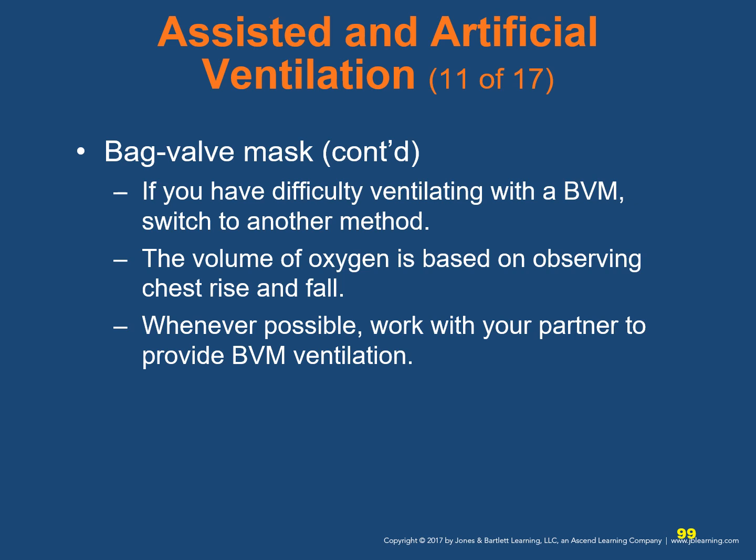Bring the lower jaw up to the mask with the last 3 fingers of your hand, as I just explained, and this helps to maintain the open airway. Squeeze the bag with your other hand until you see adequate chest rise. Perform this in a rhythmic manner once every 5 seconds for adults, once every 3 seconds for infants and children.